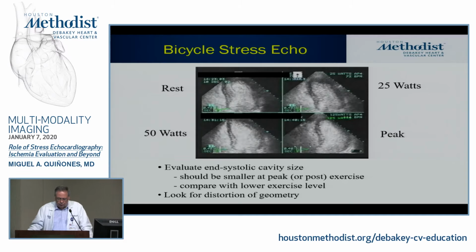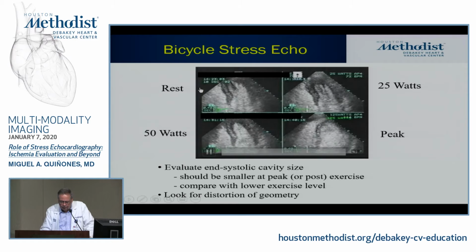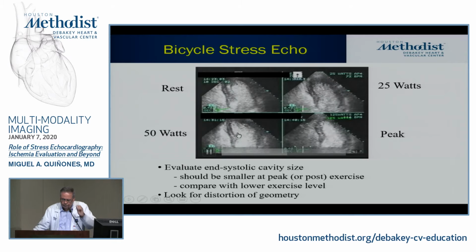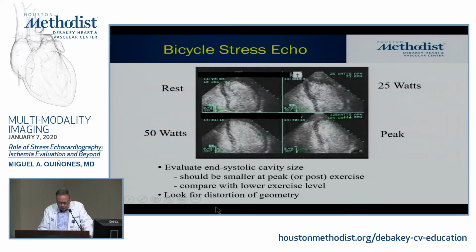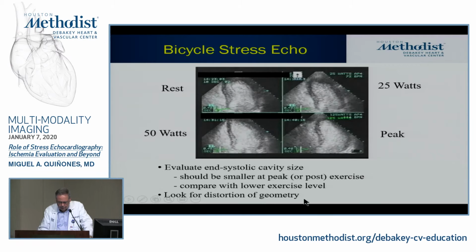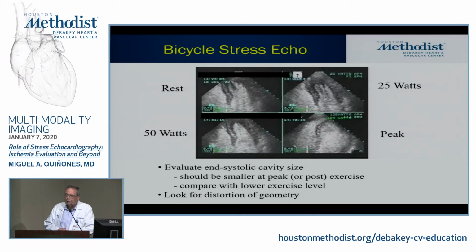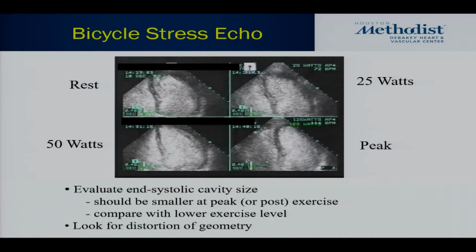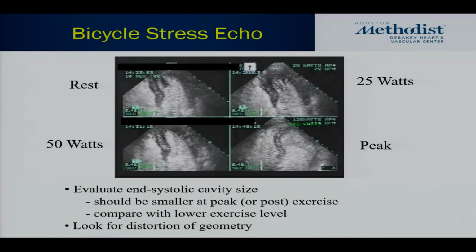So let's look at this case. What do you think? Who wants to take a peek at this one? You have a resting, beautiful 4-chamber, 25 watts, 50 watts, and the peak. And here are your tips. Just again, going through them, right? So using these concepts, who wants to take a quick crack at it? Nobody? Everybody's like stoned?